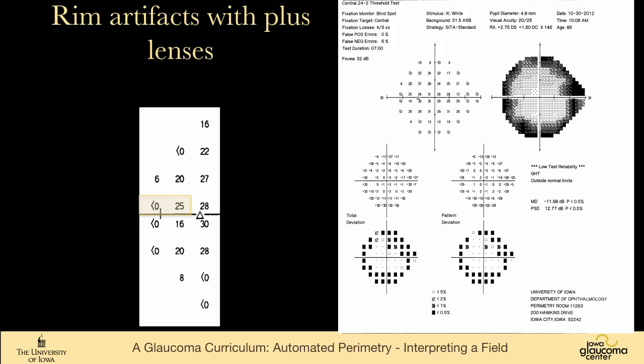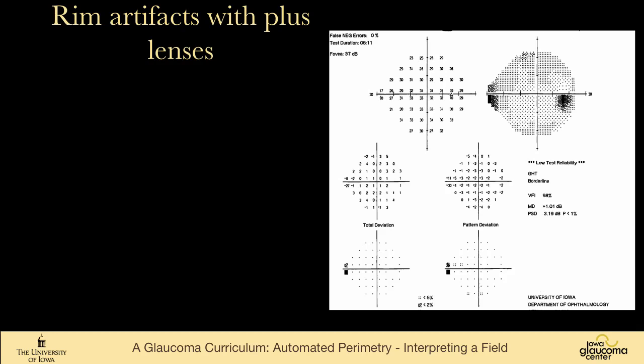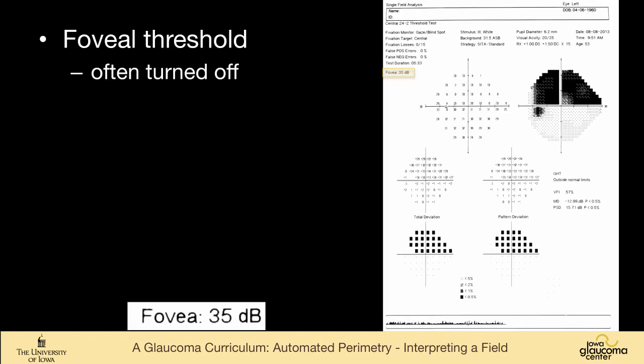I put this with prescription because rim artifacts are more commonly seen in people who have plus lenses. And a rim artifact looks just like this. You can imagine that you're seeing the rim of the correcting lens. Notice this sudden drop-off from 25 decibels to less than zero. As it's black in the very far periphery, it does not follow the nerve fiber layer pattern at all. Usually with plus lenses, it can also be in a patient who's drifting back from the headrest and the perimeter, and so they're farther away than they should be. Here's a more subtle example. You can see it's above and below doesn't follow the nerve fiber layer pattern.